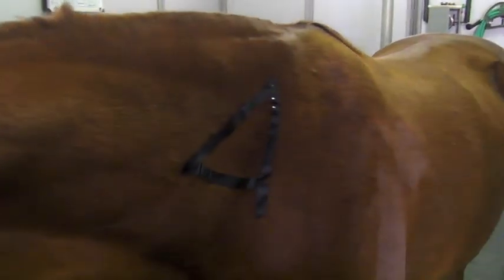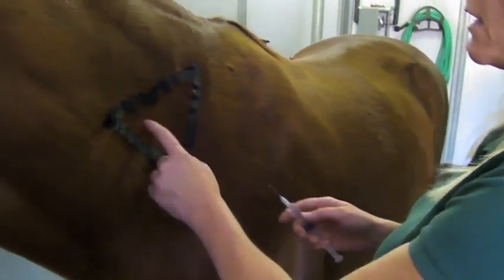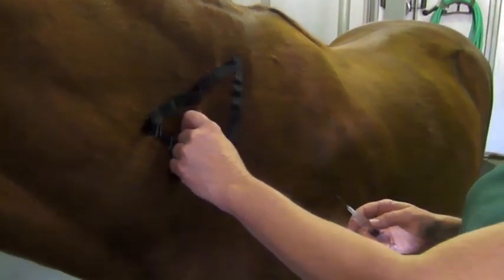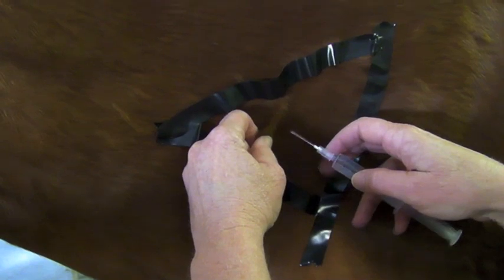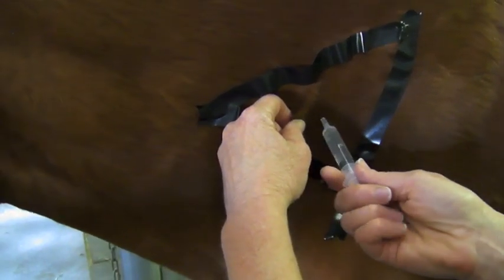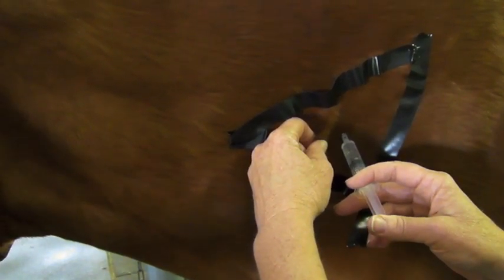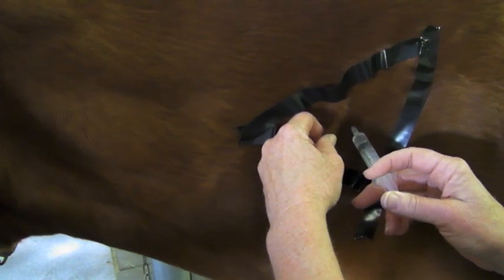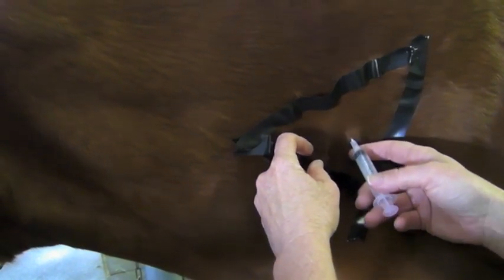Grab your shot and take the cap off the needle. I like to grab a little skin just to let them know I'm coming, but you're not going to go in at the base of the skin — that's for subcutaneous injection. Just go right in directly. Draw back to make sure you're not in a blood vessel, then with moderate pressure go ahead and push the drug in. If you get blood back, just take the needle out and insert in another location.